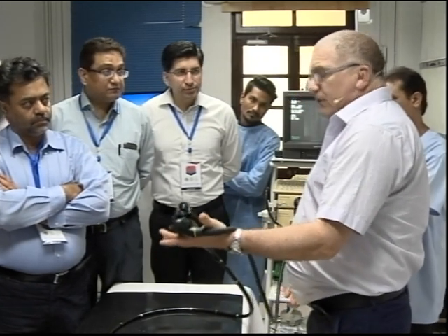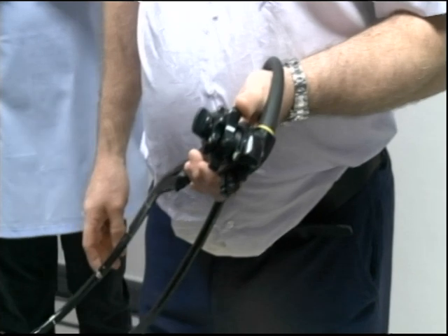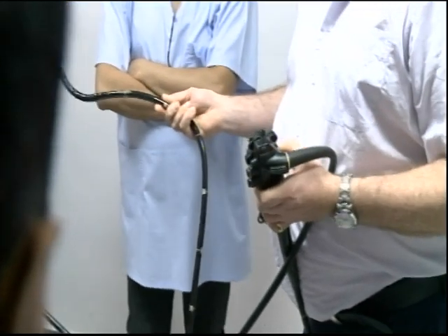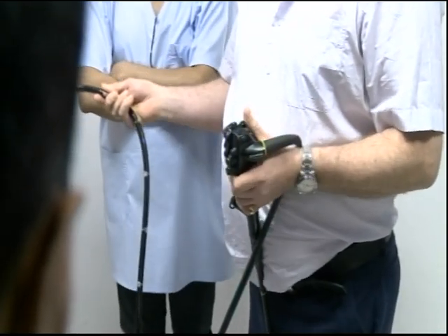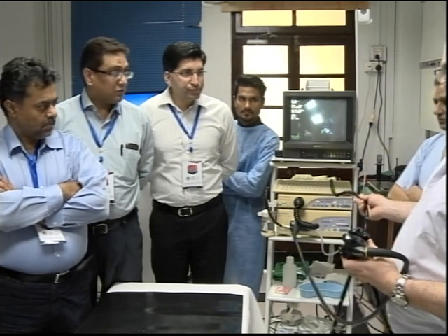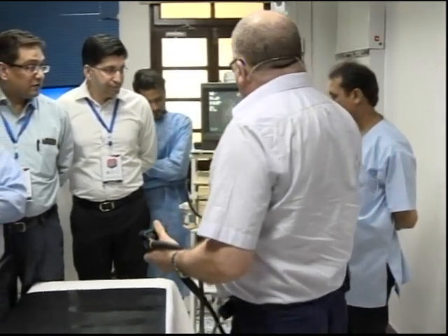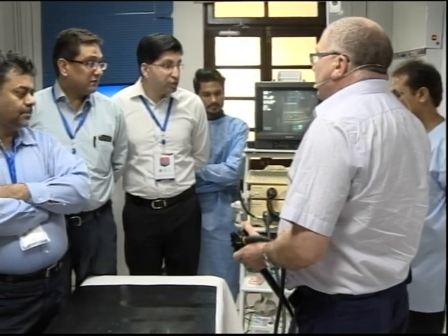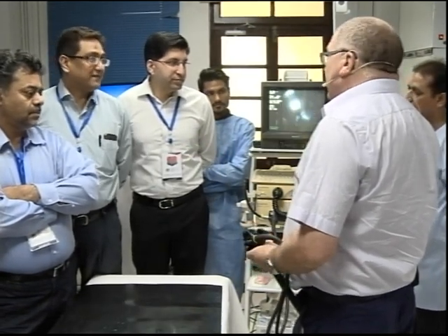You can check the wheels. So what do the wheels do? Okay. So how does the up and down work? So if we see the big wheel here, that's pointing upwards. And what does it do with the image on the screen? So I pull this back, which way does it actually point the tip? Up. So it goes to 12 o'clock. As I pull this back, that tip is going up to 12 o'clock. Pull the big wheel back, the image is still going to 12 o'clock. Okay. I've got it the right way, and it's still going to 12 o'clock.